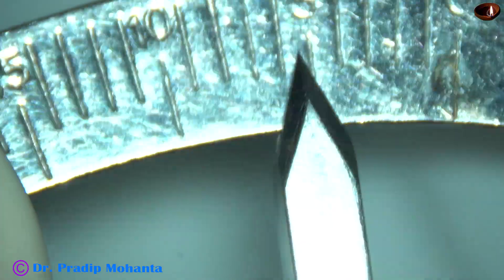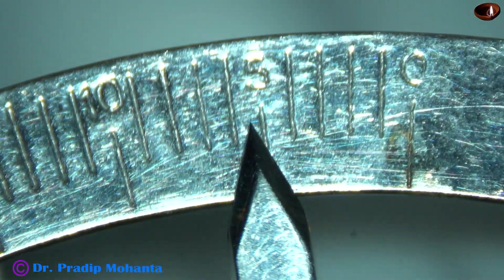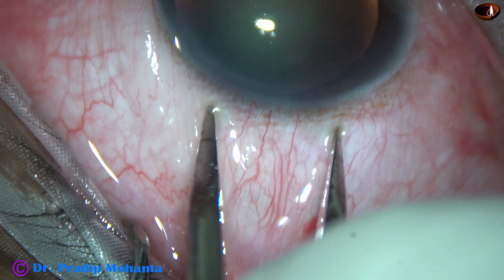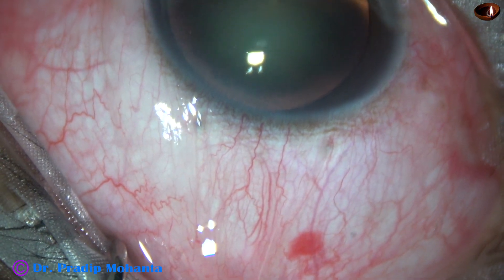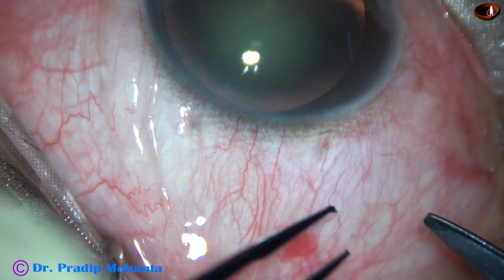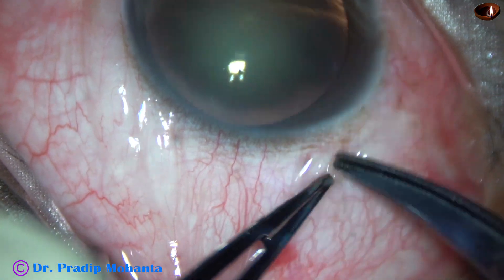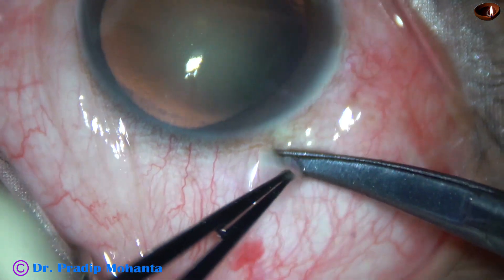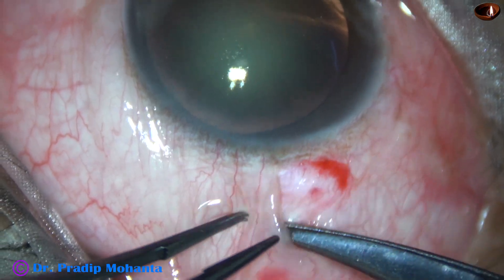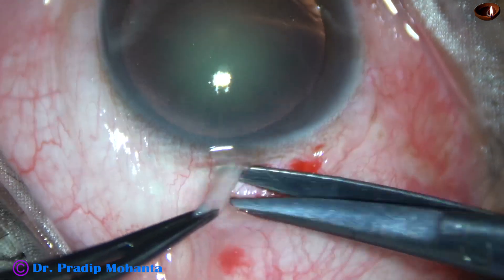This is a 5.5 mm measurement, which is going to be the wound size in this case. The intraocular lens I am going to use has an optic size of 5.25 mm. Conjunctival peritomy is being done for about 1.5 clock hours.